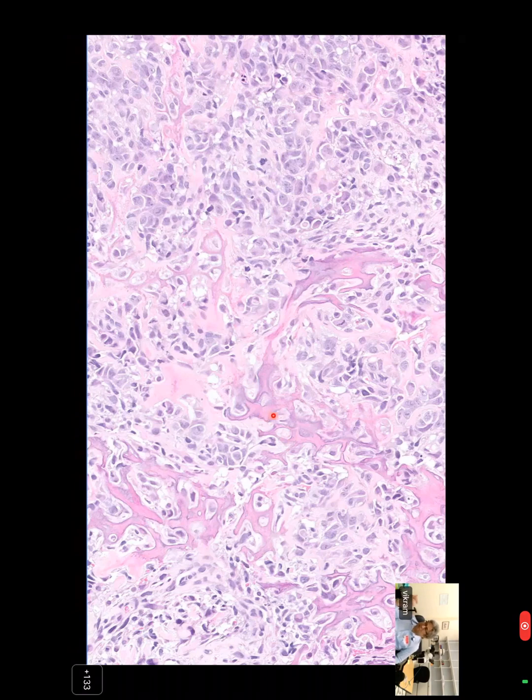One, it is bone; it's not collagen, and that can be good. That could be a big problem, because remember, the diagnosis of an osteosarcoma requires the presence of bone. And the other thing is lace-like deposition, you seldom see it in a reactive process. I'd never say never, but generally when you see a lace-like pattern, you're probably dealing with a malignant process. And the diagnosis of an osteosarcoma requires two things, right? Bone deposition, and that bone has to be surrounded by neoplastic cells.